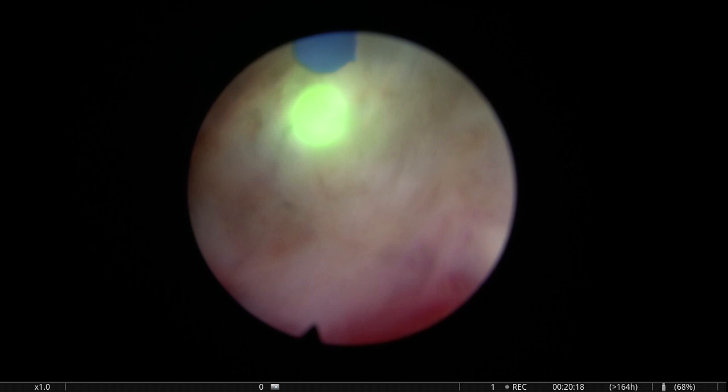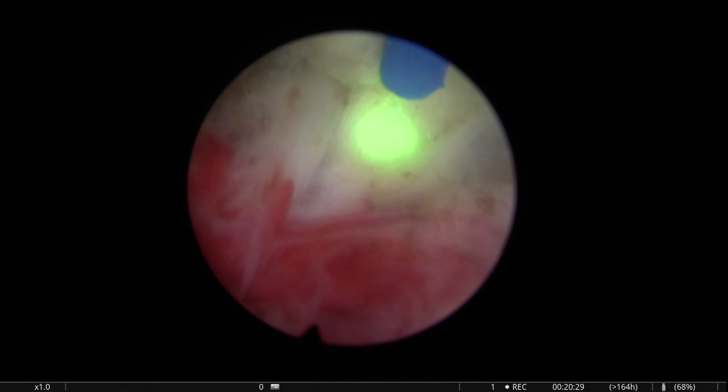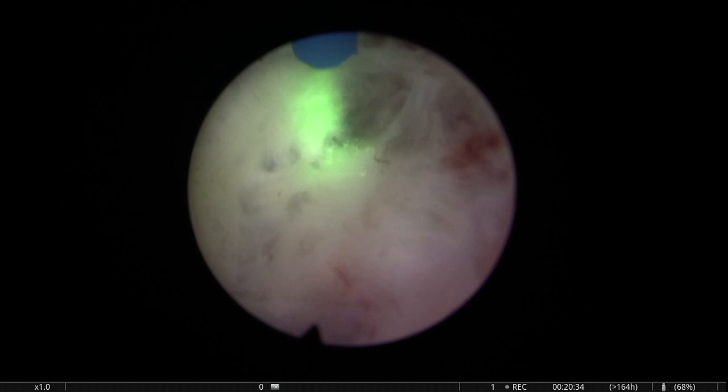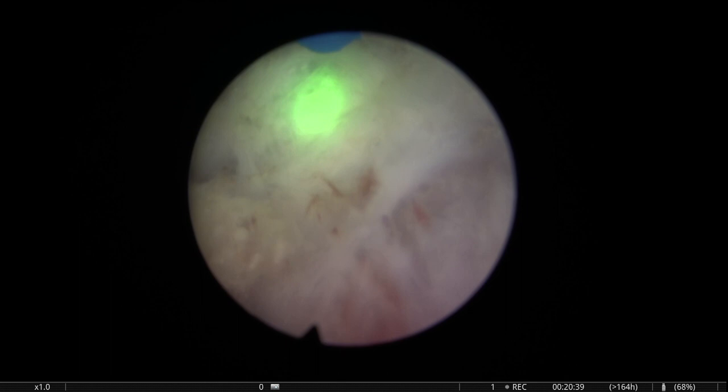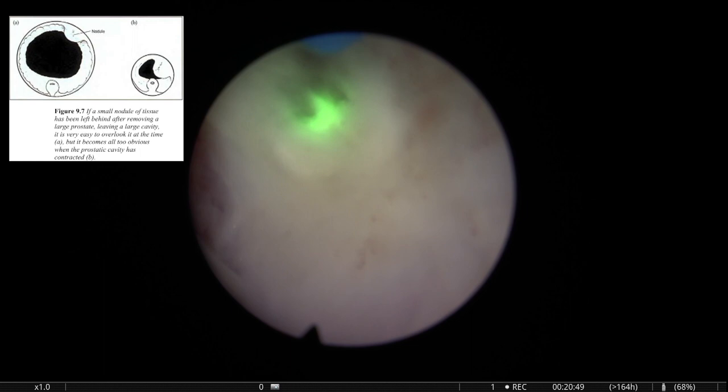So he had a graph where he showed the prostate. You see, this is again a nodule. You have to probe, you have to see if what you're doing is correct, or if you can go a little bit deeper and do a better job. Sometimes the plane is so clear that there's no doubt, but some other times you have to be guessing and trying. Okay, so John Blandy did this graphic where he showed the TUR fossa.